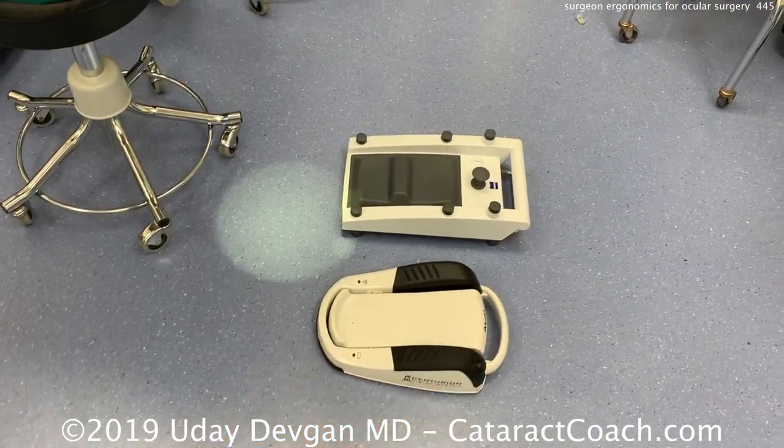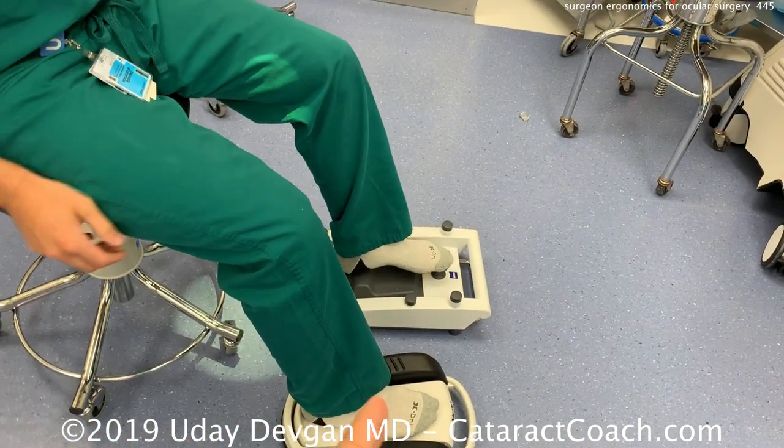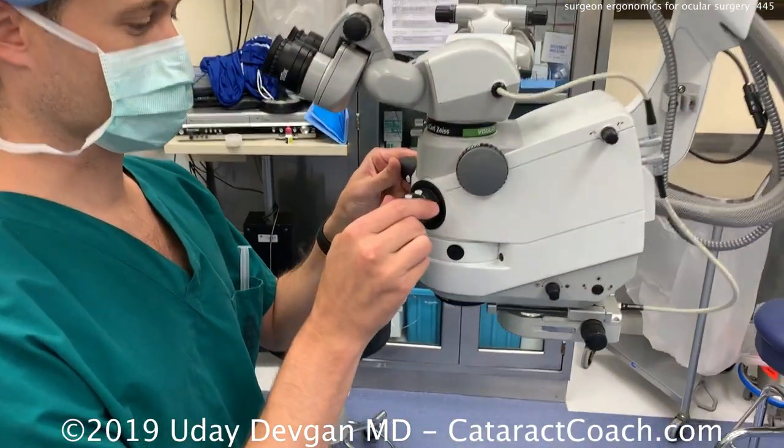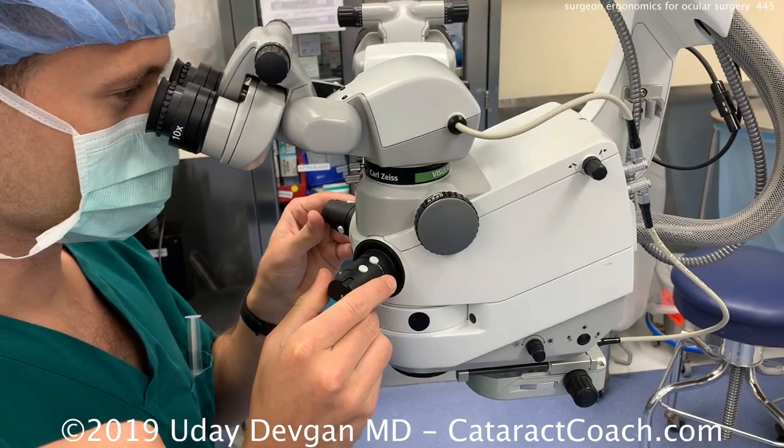I suggest a slight downward tilt. Now let's look at the phaco foot pedals. We've got two foot pedals here — I traditionally have the phaco pedal for the right foot and the microscope on the left foot. You want to have the pedals in front of you.